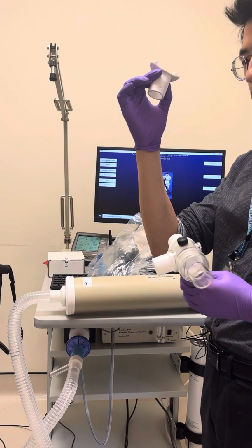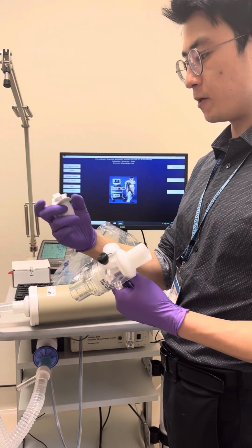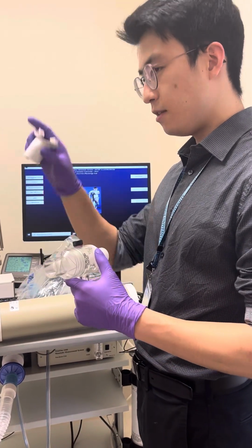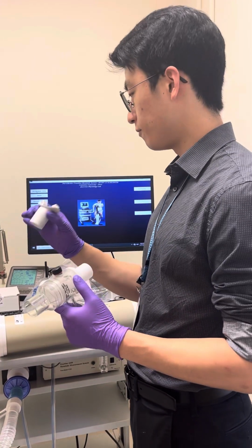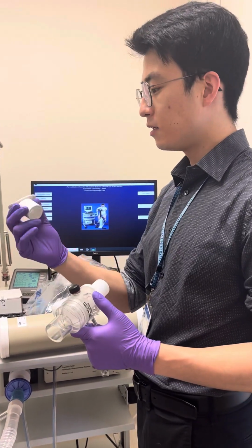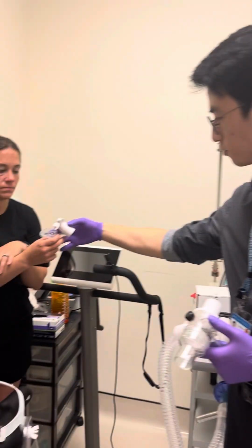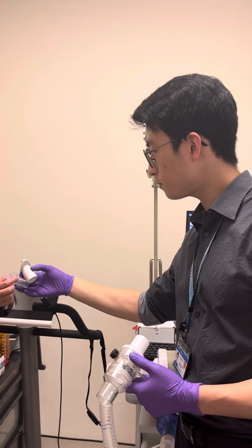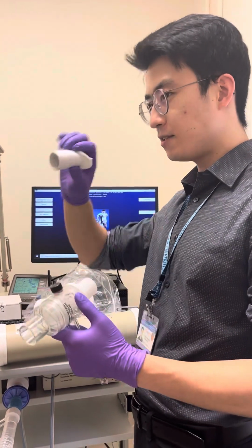The other part you need is a mouthpiece, and this is what the patient will actually be biting down on. And I have several of these here. These are the ones produced by Medical Graphics, and they're more comfortable, I think, than that thing right there. I mean, that's pretty big, right? This is much easier to bite down on. The problem is that the opening is a little small.